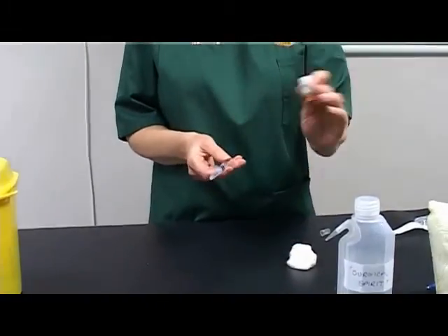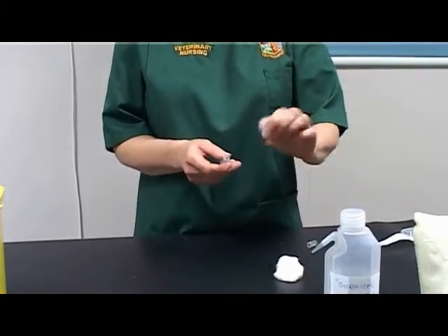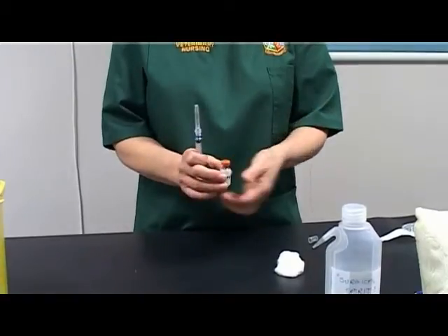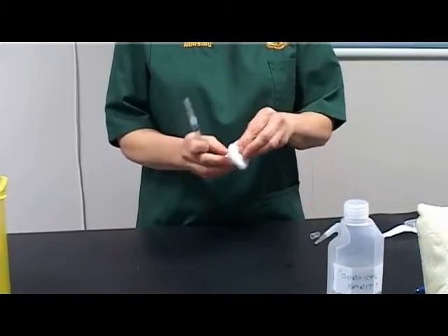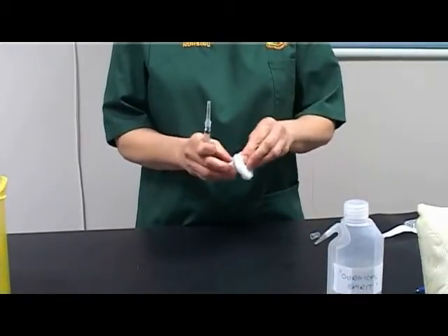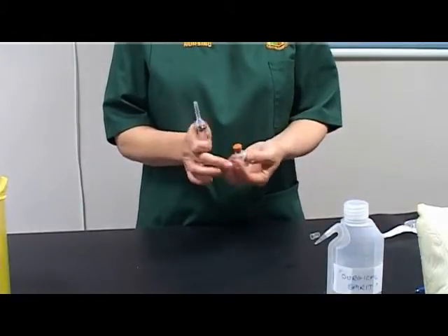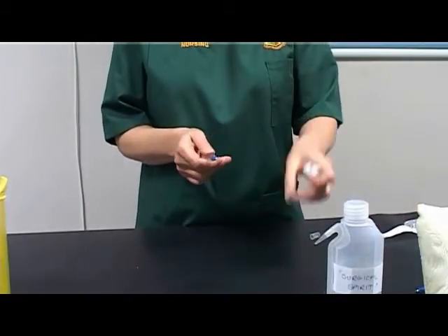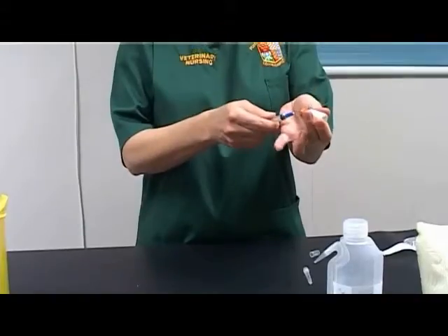Shake the vial to mix the contents. Swab the top of the vial. Introduce the needle to the vial aseptically.